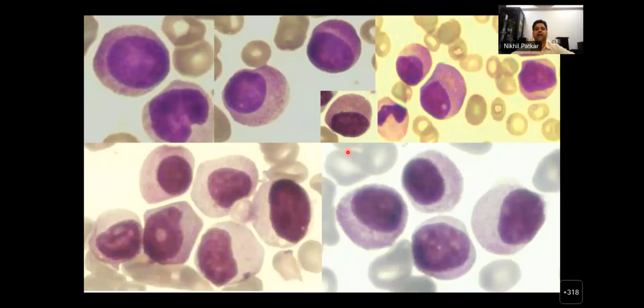All right, so a 45-year-old male with fatigue found to have petechiae, leukocytosis, and blasts in the peripheral blood. So go on. What do we see here? So in this peripheral blood smear, we see a large amount of myeloid lineage cells, most probably. Well, at this point, you can just see that there is leukocytosis. The count is high. I can't see anything. Okay, but at higher power, what do you see?